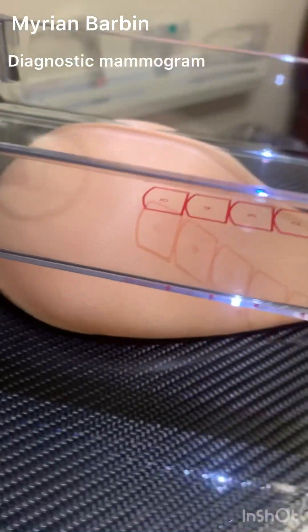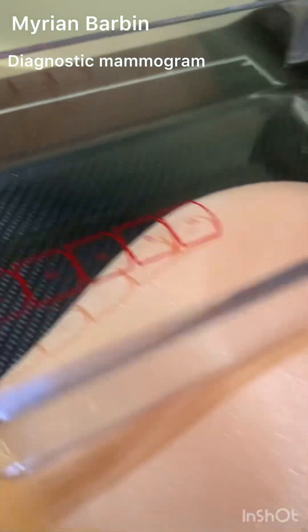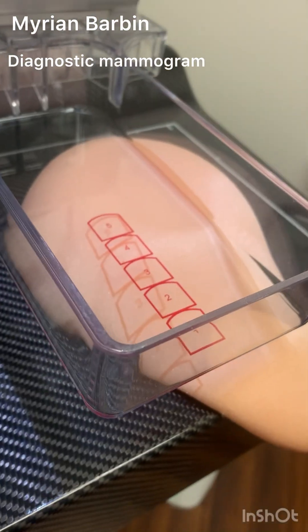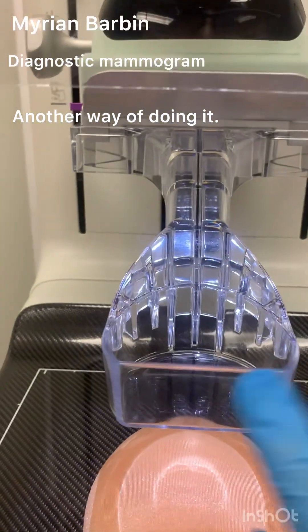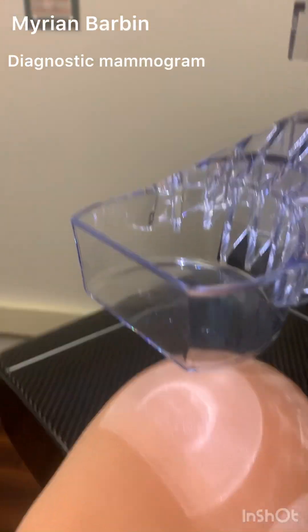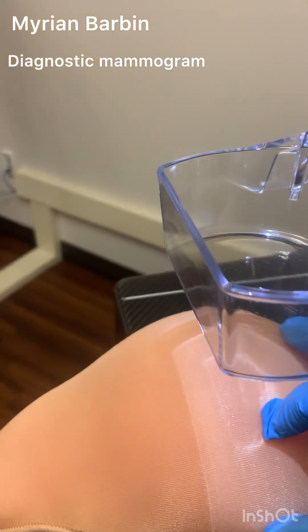It is smoothing out that abnormal breast tissue, or it is magnifying that area in the breast that could be of concern or just to take a closer look at. You can also use this smaller spot compression paddle if you want to just focus on a smaller area of the breast, or if a patient has smaller breast tissue as well.